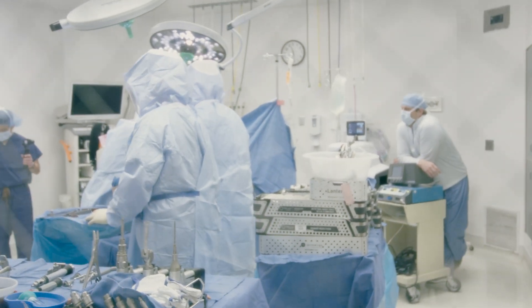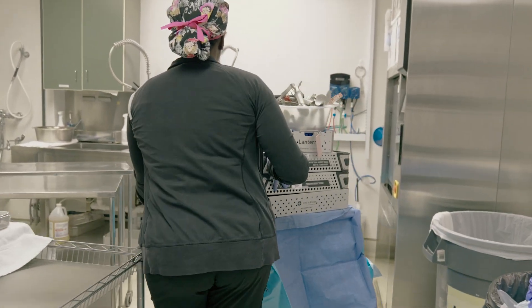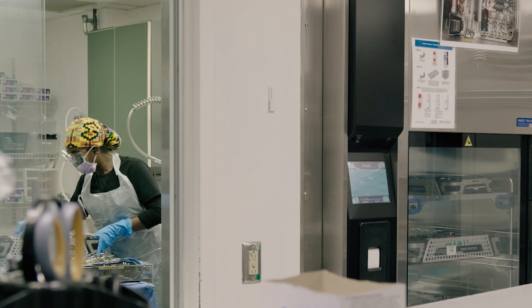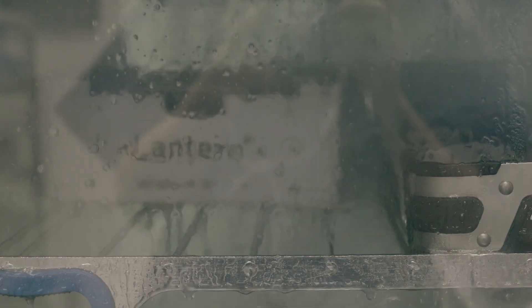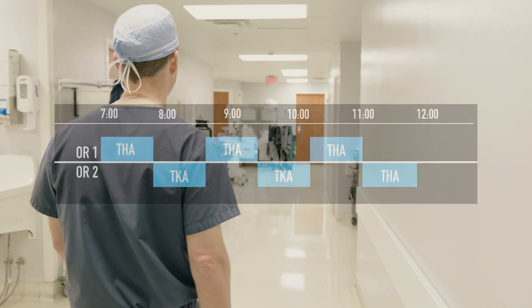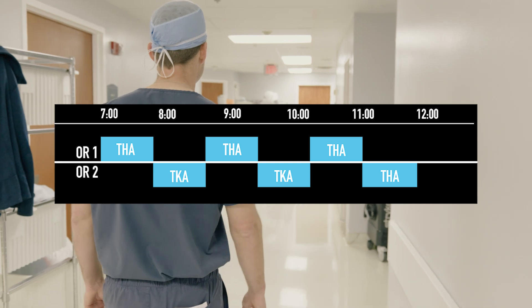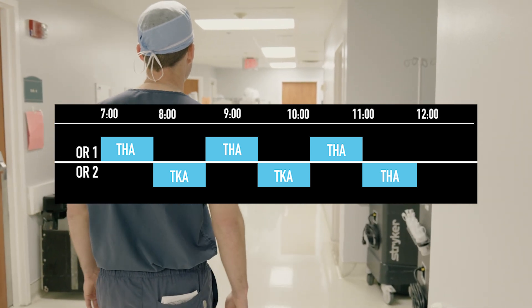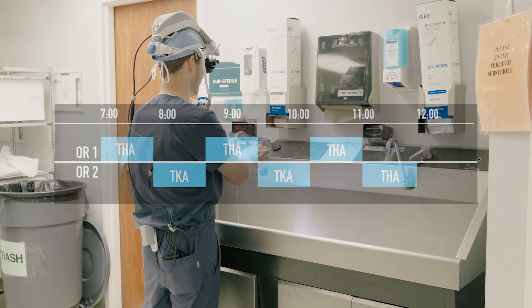From an adult reconstructive standpoint, we're doing about 10 to 12 cases a week. We also are doing a significant amount of sports medicine as well as hand surgeries. Compared to a large hospital OR setting, the surgery center still processing room is significantly smaller, which encourages us to become more creative with processing of multiple trays. We're planning on performing four primary hips and two primary knee replacements today with two rooms, flipping back and forth, trying to be as efficient as we can. We're starting at 7 a.m. today and planning on being finished by noon.